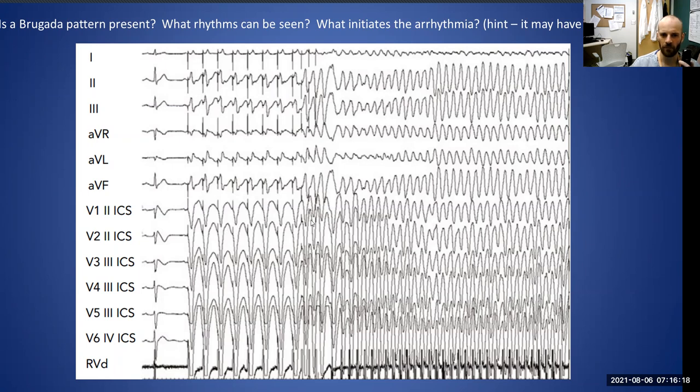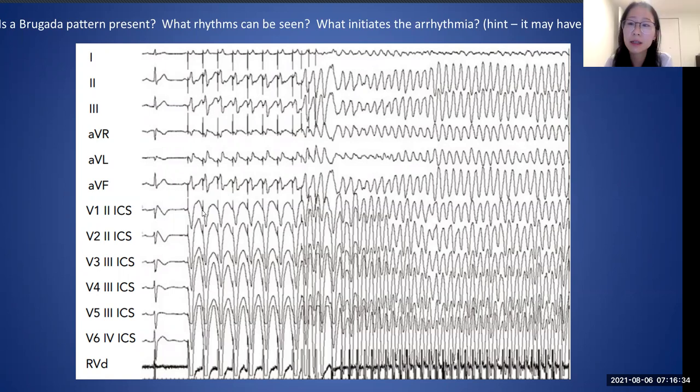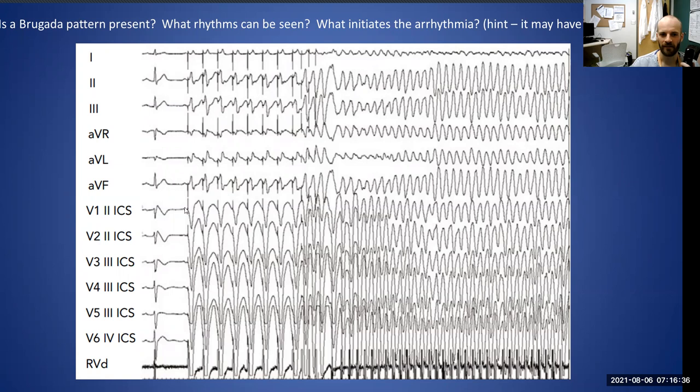And every QRS complex looks the same. Okay, so to give you a clue, if these are the QRS complexes here, if we're looking in V1, we've got these broad, deep V's in V1. What do you think that little thing is before the V? That's a pacing spike. A pacing spike, absolutely. So pacing spikes going on here.